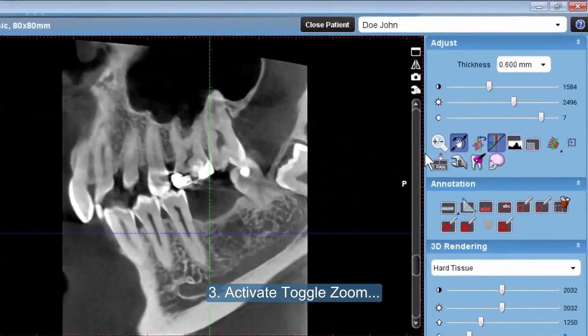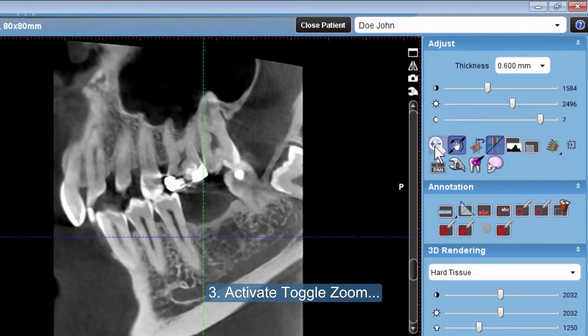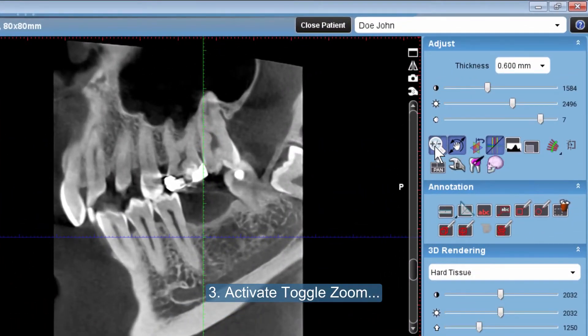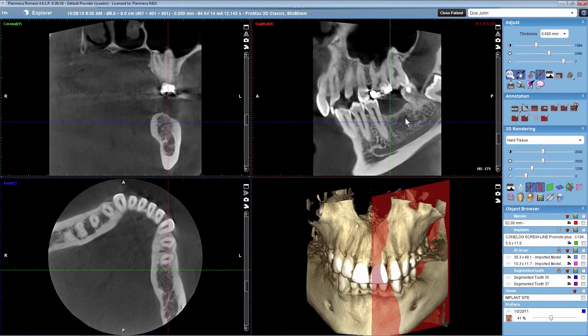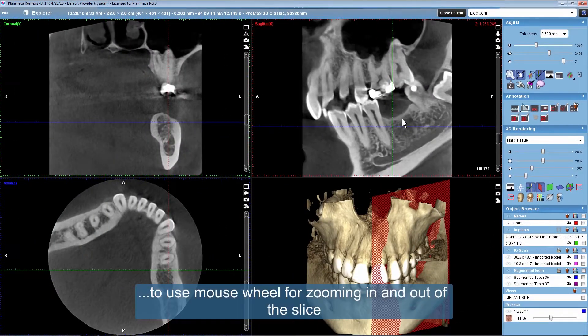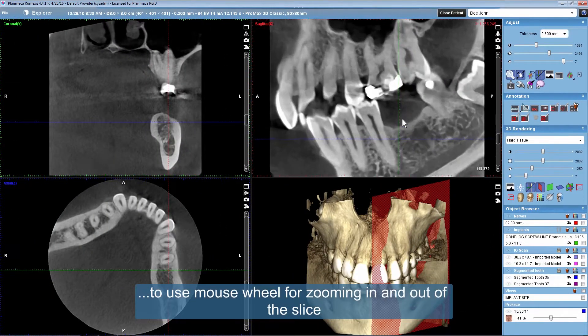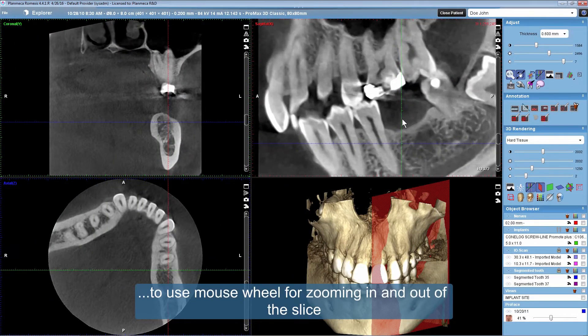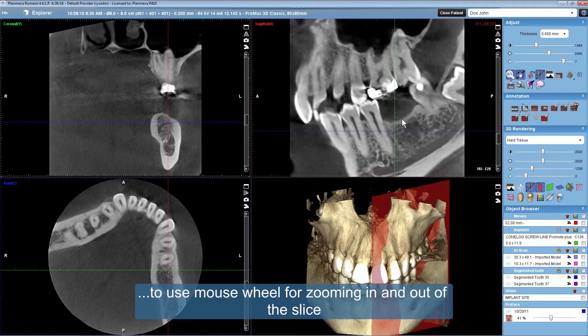Activate toggle zoom to use the mouse wheel for zooming in and out of the slice.